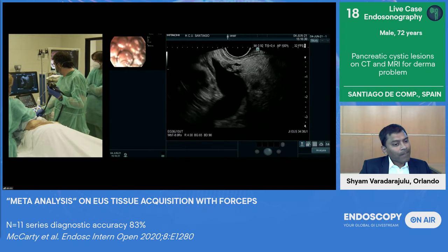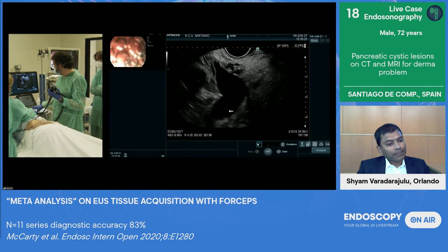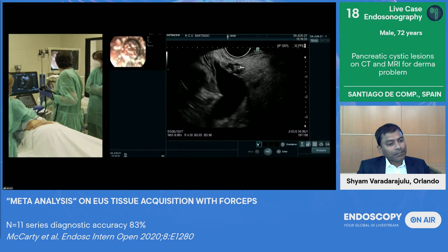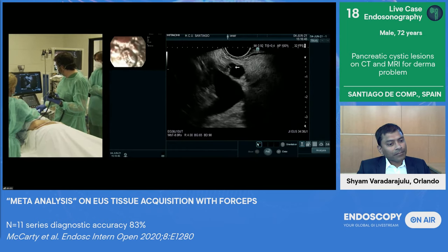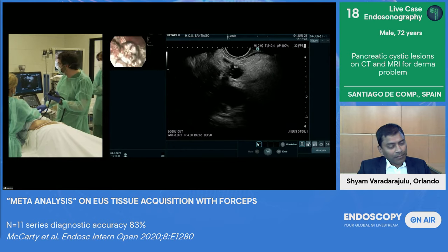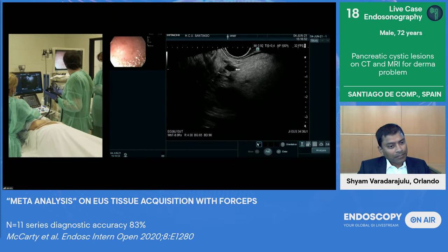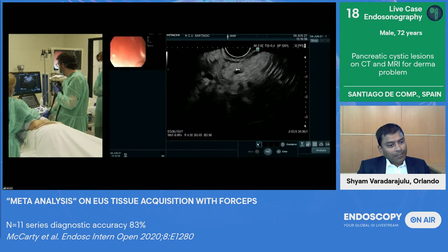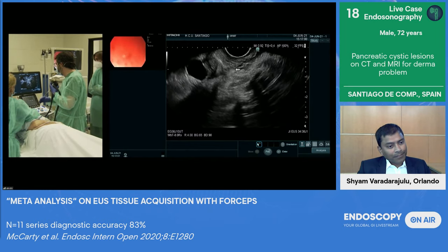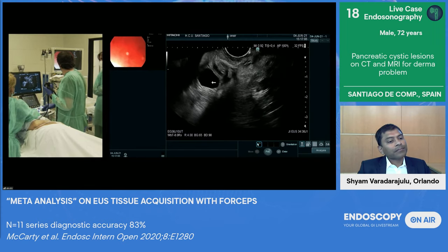And this is probably the best reference for the diagnostic approach. This is the portal vein, this is the splenic vein, we're at the confluence, so this is the pancreatic head, and this is another complex cystic lesion that we have in the pancreatic head. This is another one, very much related. Up here we have the CBD, which is non-dilated. So the important thing is we still see a fatty pancreas, we see cystic lesions, but we are not detecting solid lesions in the exploration. So I'm making a clockwise rotation, and I'm coming to the ampulla. This is another cystic pancreatic lesion close to the ampulla.